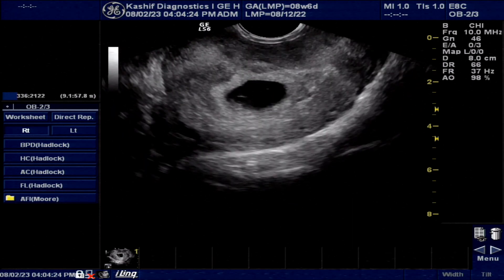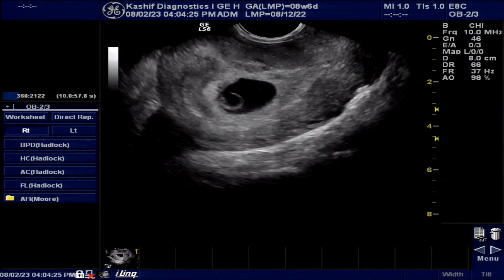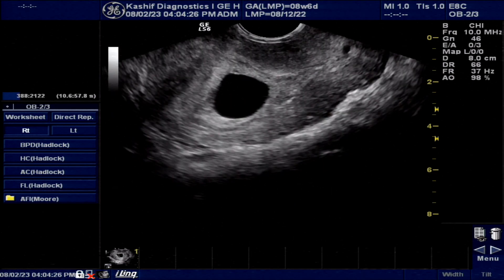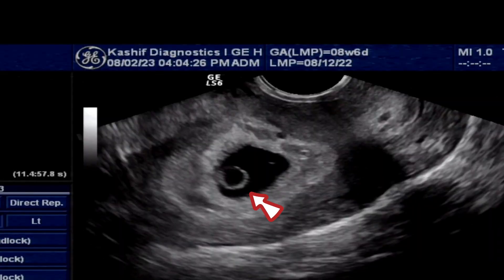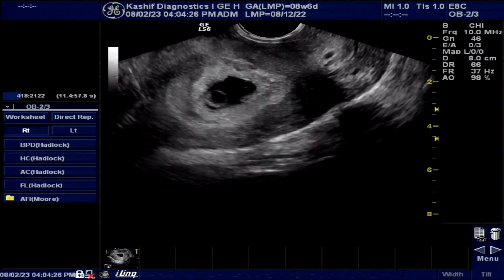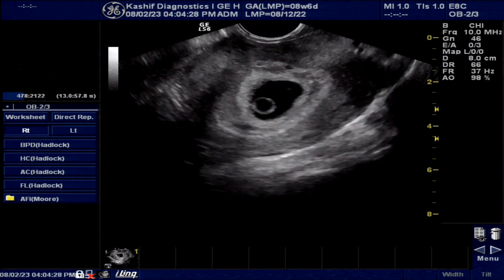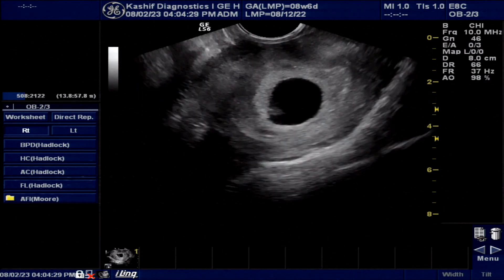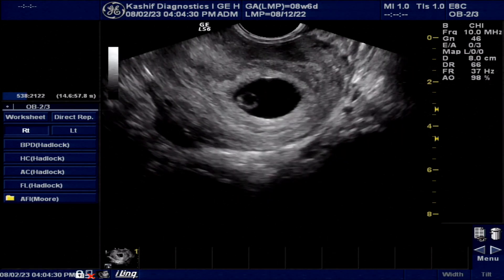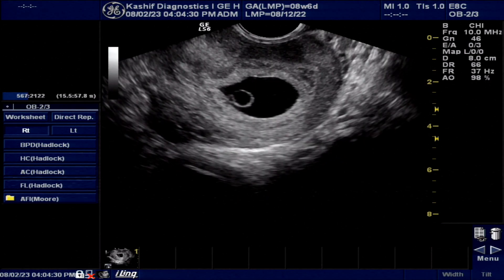A yolk sac is visualized within the gestational sac. The normal size of a yolk sac is 3 to 5 mm. In this case, the size of the yolk sac is increased at 7 mm.